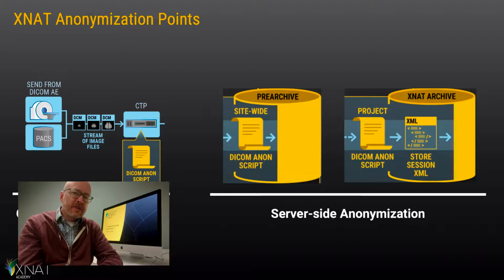Inside XNAT, there are 2 server-side anonymization points. The site-wide anonymization script is applied during the initial importer process as the data is being imported into the pre-archive. And then project anonymization scripts are applied during the archiving process of moving the session data from the pre-archive to the final project-specific folder in the archive. How and where you set up your scripts will depend on your import method, how many projects you plan to support, and what your IRB requirements are.